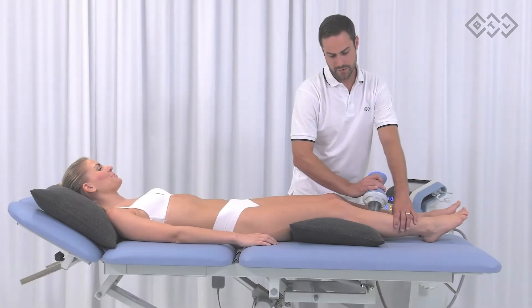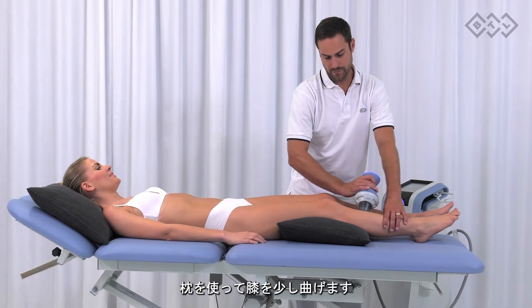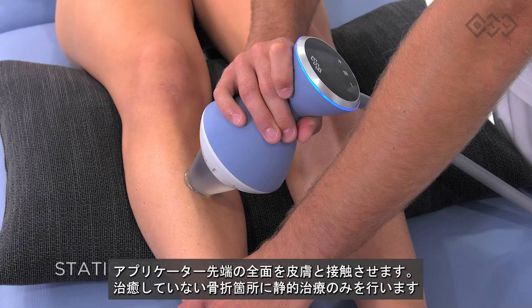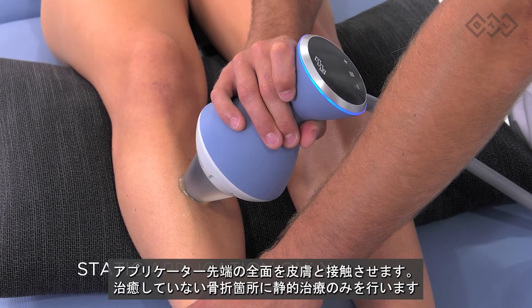Tibial nonunion. Make sure that the patient is in a relaxed position. Use the pillow to slightly bend the knees. Apply full contact therapy and perform only static application in the place of the unhealed fracture.